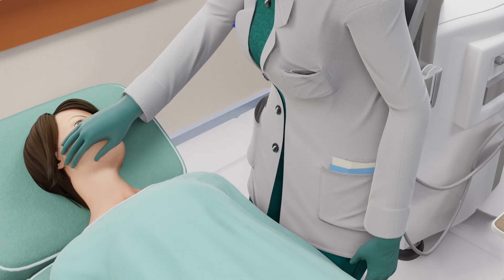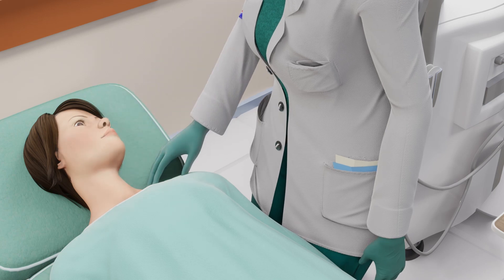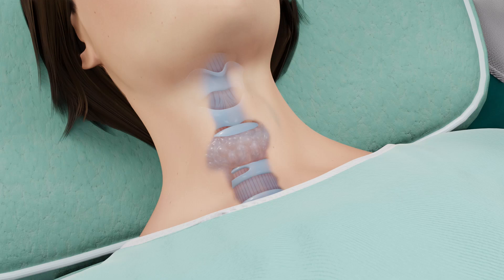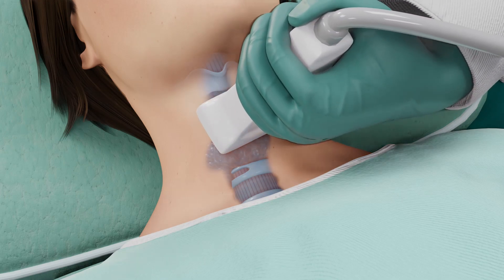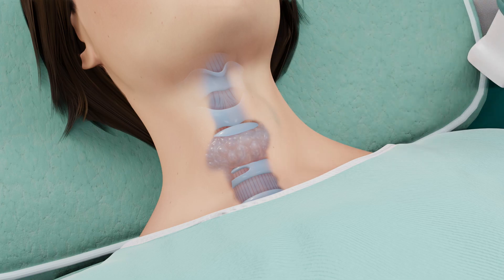Ear pain and jaw pain are also possible side effects of this procedure. You should let your doctor know if you experience any of these symptoms. Once the nodule is treated completely, the doctor will perform a final ultrasound scan to ensure the best possible results.